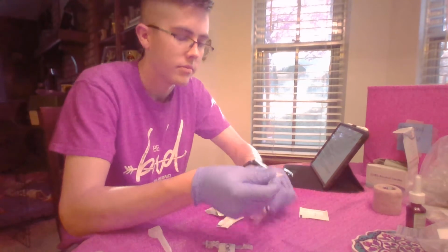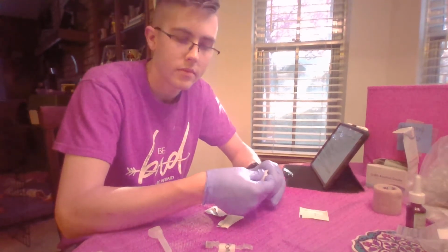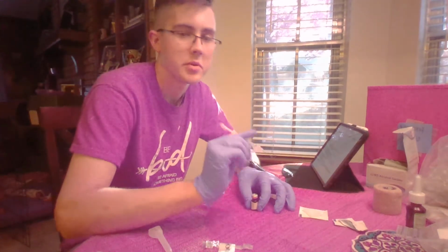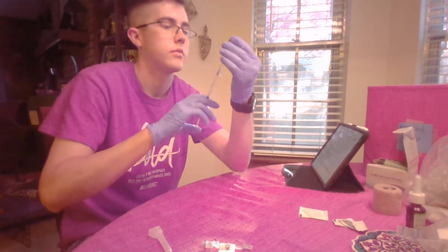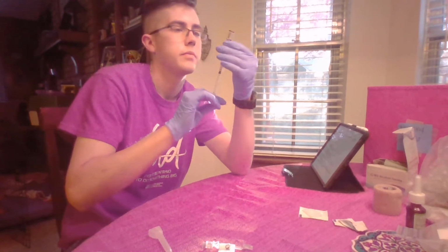Going to clean top of my medication. Going to be using that for the next 5 attempts, and then I will start a new one for my new scenario. Set this down. Inject my 1 milliliter of air.